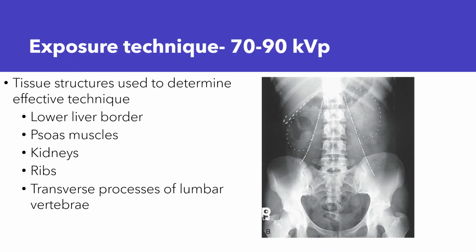And yes, that's a registry question. And then the transverse process of the lumbar vertebrae, that's kind of hard to see on this radiograph, but there's little bony projections sticking out into the psoas muscles to each side of the lumbar vertebrae. I'll definitely point them out to you either in lab or in image critique. I'll show you where those transverse processes are if you can't make them out here.